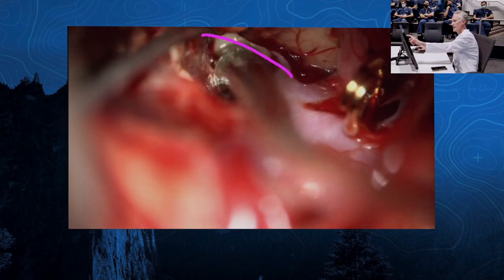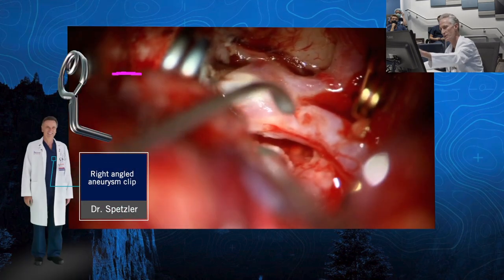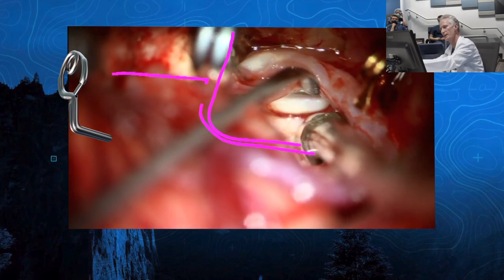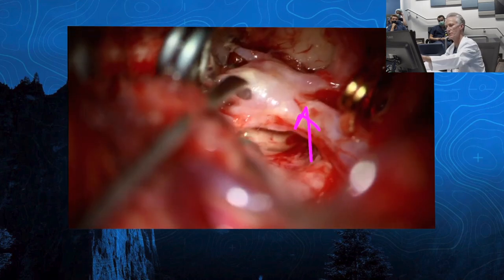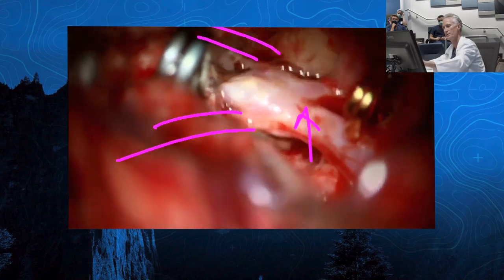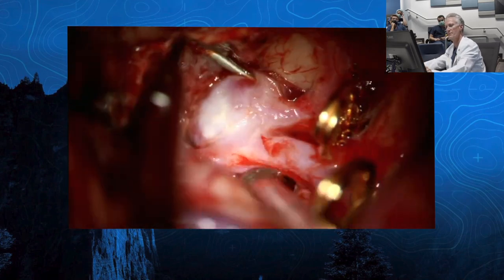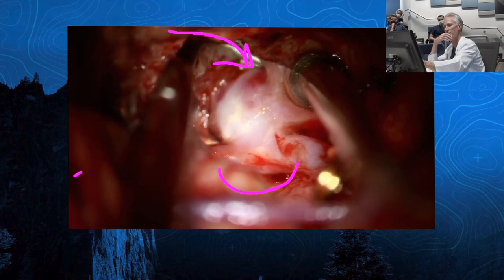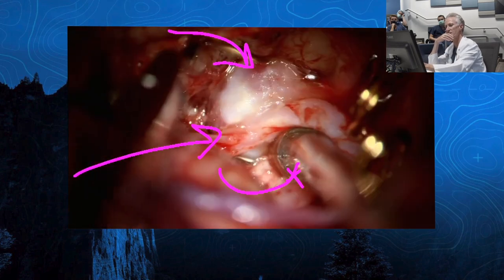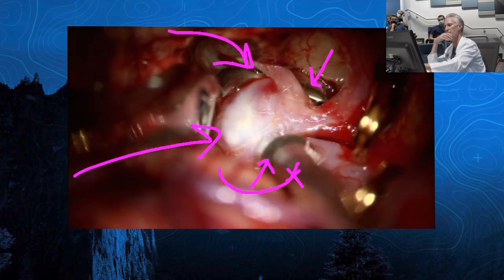The contralateral neck is in that plane over here. You've got to get a clip that goes down the backside of this aneurysm. So what I ended up doing was using a right-angle clip — this clip goes in this way but then down like so. You can see the blade under there. Here's that aneurysm on the backside that is really hard to see. This is the ipsilateral A2, contralateral A2, and it took that right-angle clip. You've got to nail that little cleavage plane there, line up this one here, and then hit this target down there. So I'm looking for the blade — there it is — looking for the blade up in here.